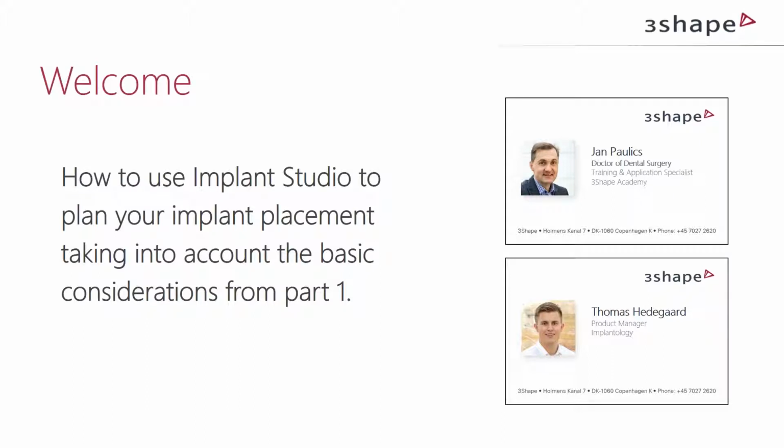So as briefly mentioned, we're going to look very much at how to actually implement the basic considerations that we covered in part 1, Jan, in the actual software and how to operate the software a little bit more. But first, I believe we should just start with a quick recap of what we discussed in the first part 1 series webinar for those of you who didn't have the time to tune in on that.